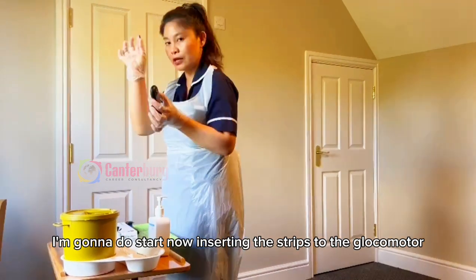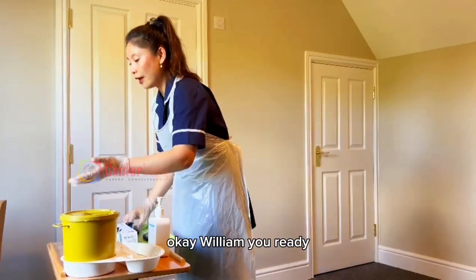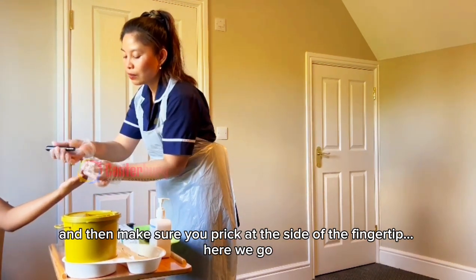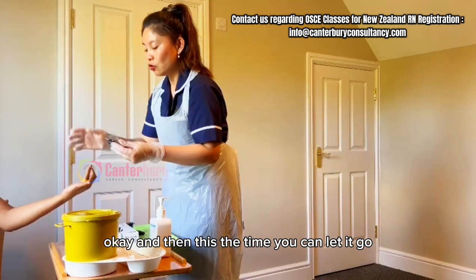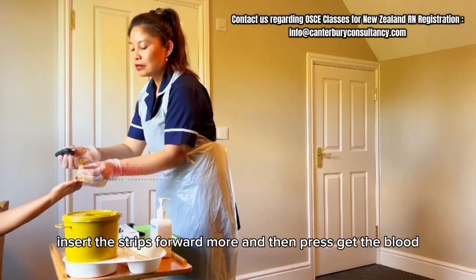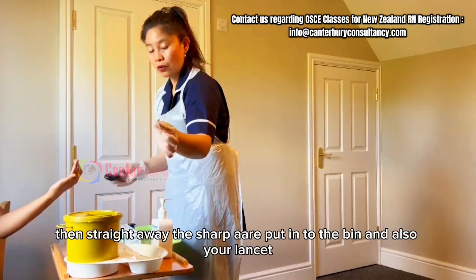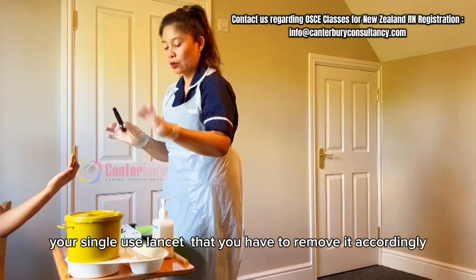Now I'm going to start inserting the strip into the glucometer. Get it ready but do not push it forward yet. William, are you ready? I'm going to use the ring finger edge. You have to press and make sure to prick on the side of the fingertip. Here we go. Now you can let it go. Insert the strip further in and press to get the blood — make sure it covers the edge of the strip. Once you get the blood, straightaway apply it to the strip. Then your single-use lancet — remove it and dispose of it in the sharps container accordingly.